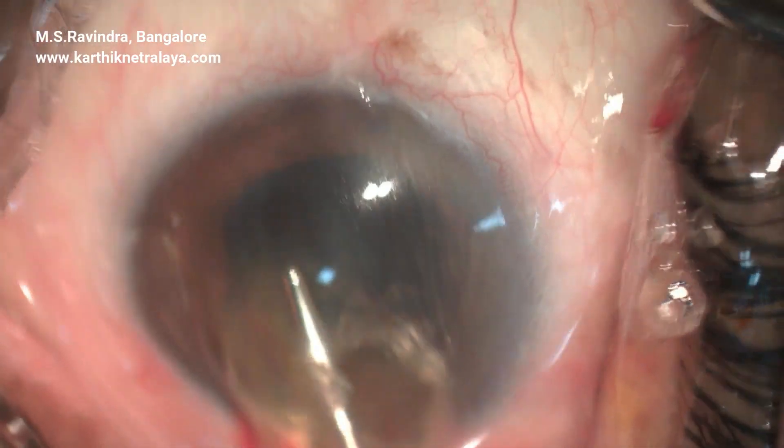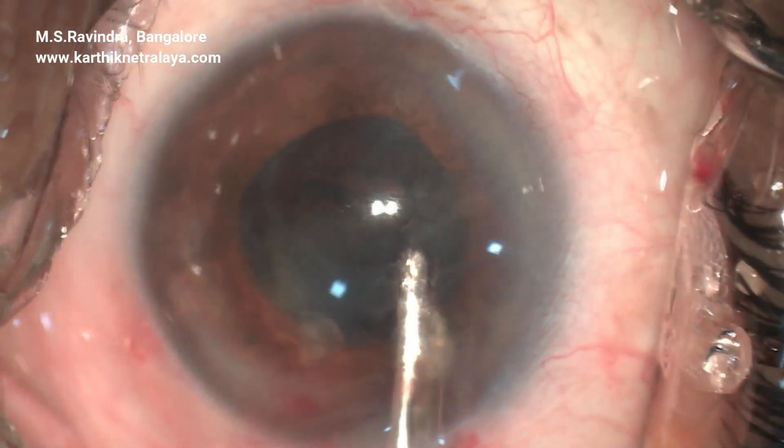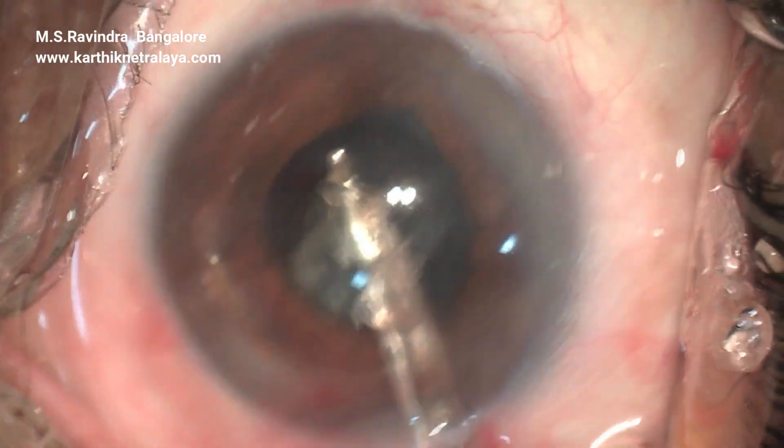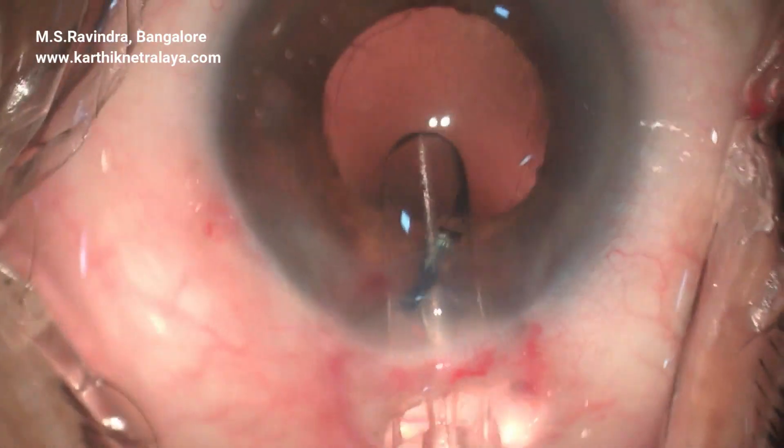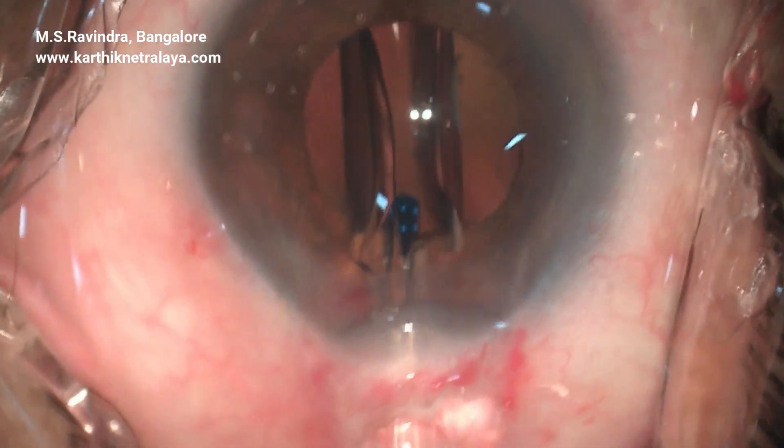This is a very interesting case. Tearing of the anterior capsule was possible but the zonules still remain. As you can see here at the edge of the rhexis, zonular filaments are seen protruding into the anterior chamber.